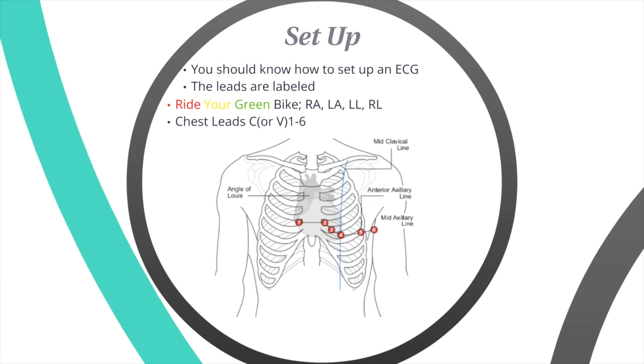You had to go in and set up the ECG with all the leads in the correct places, and state where you were going to put them if they weren't sticking. After that, you get handed a piece of paper with an ECG readout, and you are required to present, interpret and answer questions from it. So it's very important that you know how to do this.